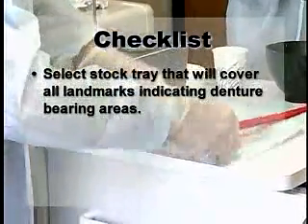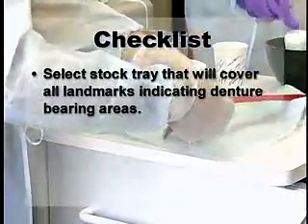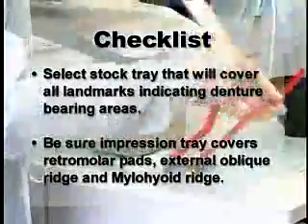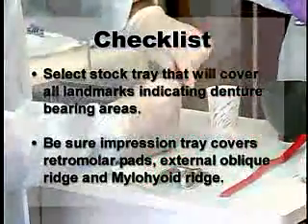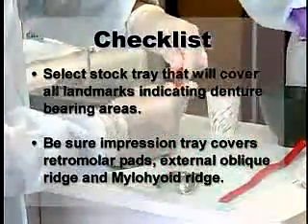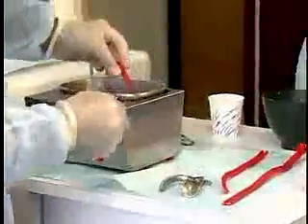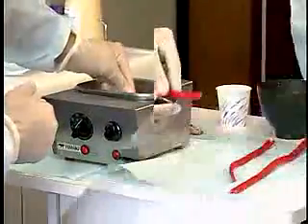Select a stock tray that will cover all landmarks indicating the denture bearing areas. Also check the impression tray and make sure it covers the retromolar pad, external oblique ridge, and mylohyoid ridge. Any deficient area should be corrected with utility wax.